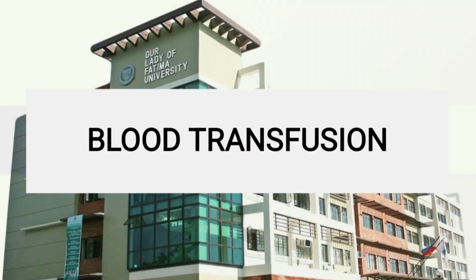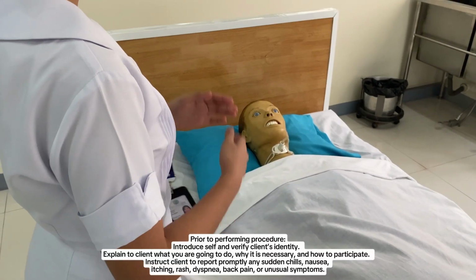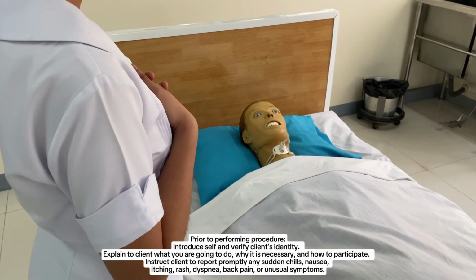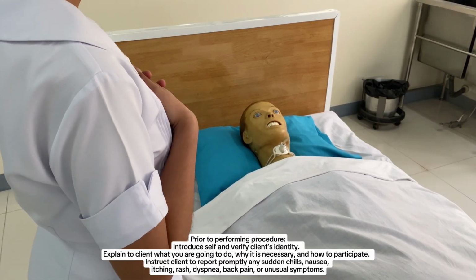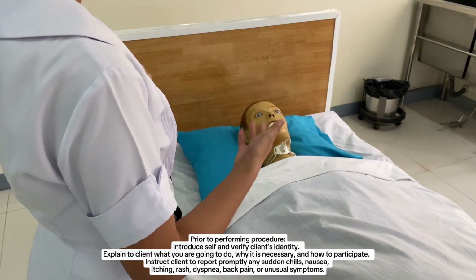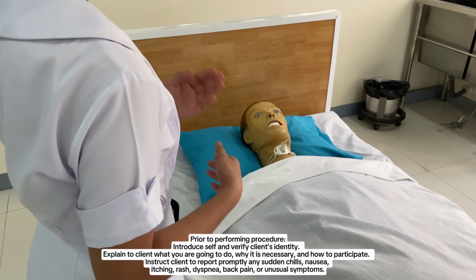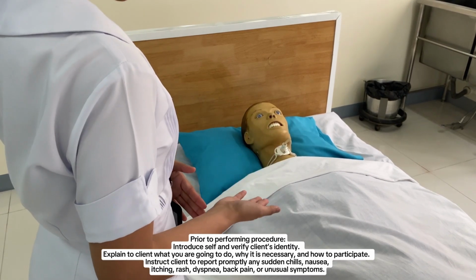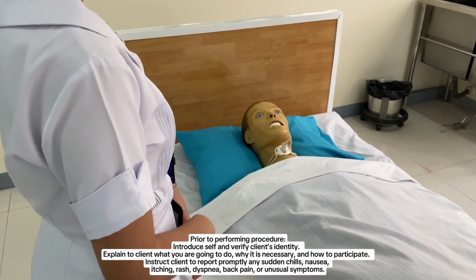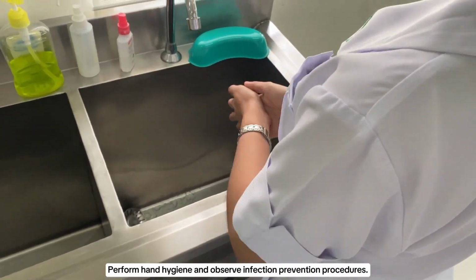Next is the demonstration of blood transfusion. Prior to performing the procedure, introduce yourself and verify the client's identity. Explain to the client what you are going to do, why it is necessary, and how to participate, and instruct them to report promptly any sudden chills, nausea, itching, rash, dyspnea, back pain, or unusual symptoms. Perform hand hygiene and observe infection prevention procedures.